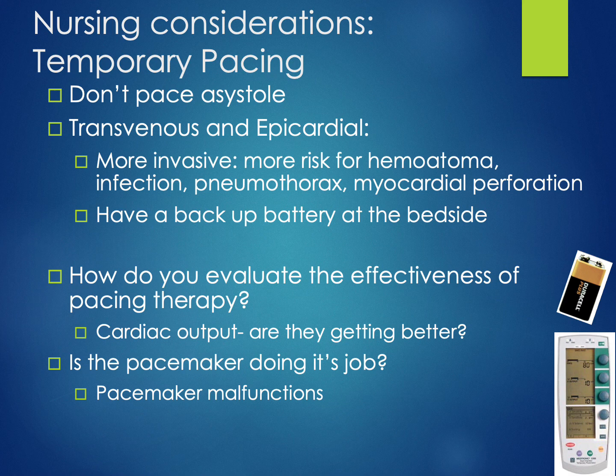So think back to basics. If the point of pacing my patient is to increase their heart rate and truly improve their cardiac output, then I should start seeing signs of improved cardiac output. Now, on a second-by-second basis, I can look at that EKG strip and see if the pacemaker itself is doing its job. Is it delivering enough electricity? Is it delivering impulses at the right time? Is the patient's heart responding appropriately? And this is when we get into the nitty-gritty potential malfunctions of the pacemaker and how to watch for those. So we'll discuss those next.